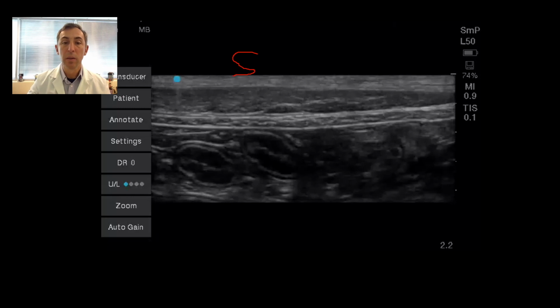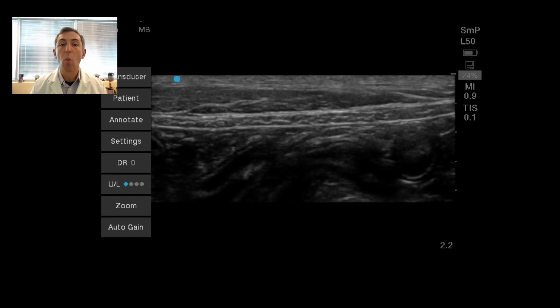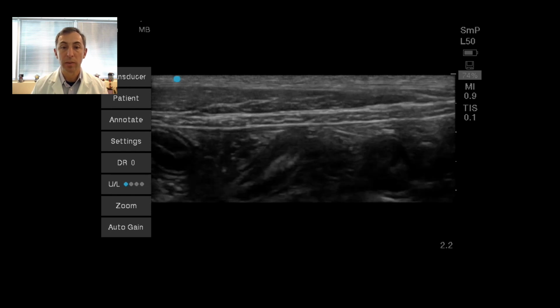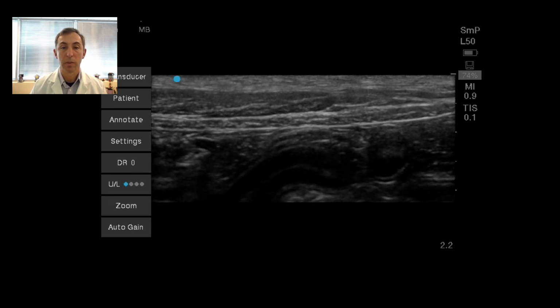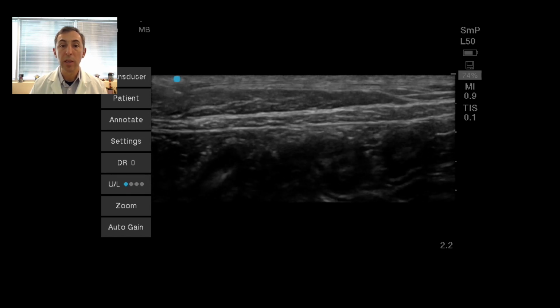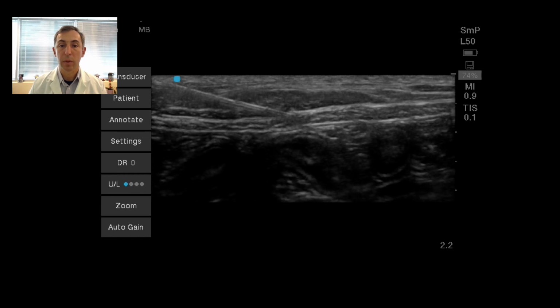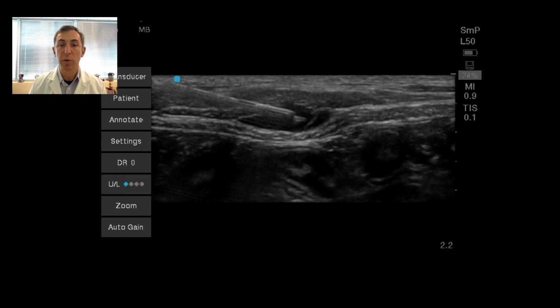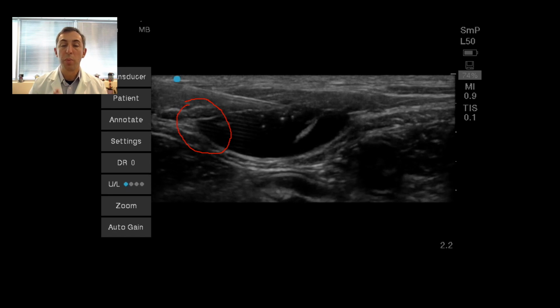We have skin, intestines, peritoneum, the dot indicating where the needle is going to enter, and let's play the video. You can see the peristaltic movements, the peritoneal wall moving with the peristaltic movements. Now the needle is entering through the skin, through the muscles. Test injection was perfect, and you can clearly see this void being created and those two lines opening as I was describing before.